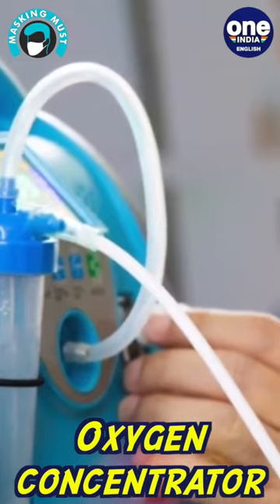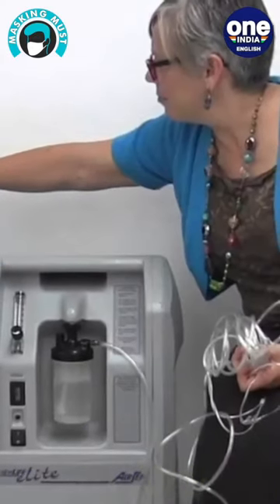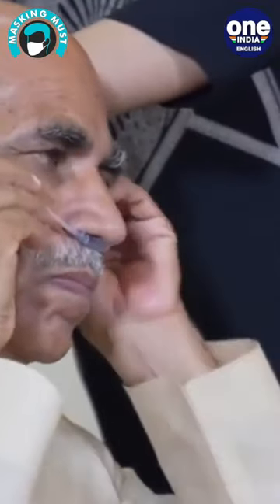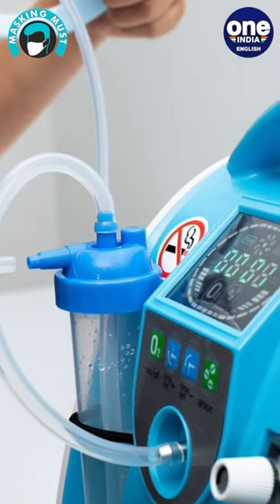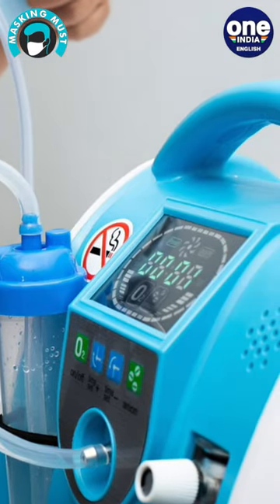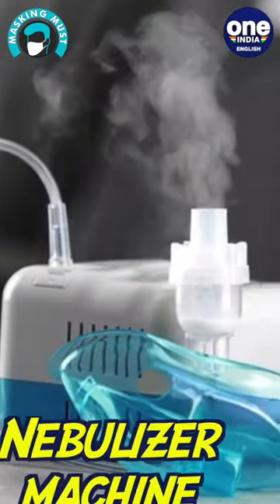Oxygen concentrators are simple devices that can take in ambient air and increase the oxygen concentration by filtering out and throwing away nitrogen. They work the same way in supplying oxygen needed by the body as oxygen tanks or cylinders, with the use of a cannula, oxygen masks, or nasal tubes. The difference is that while cylinders need to be refilled, the oxygen concentrators can work 24/7.